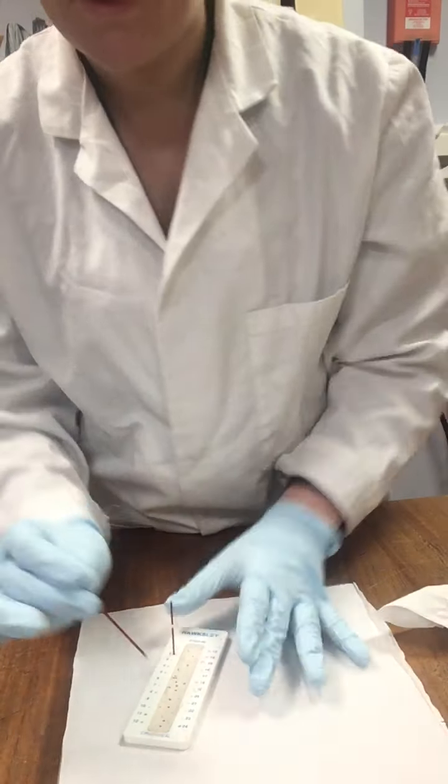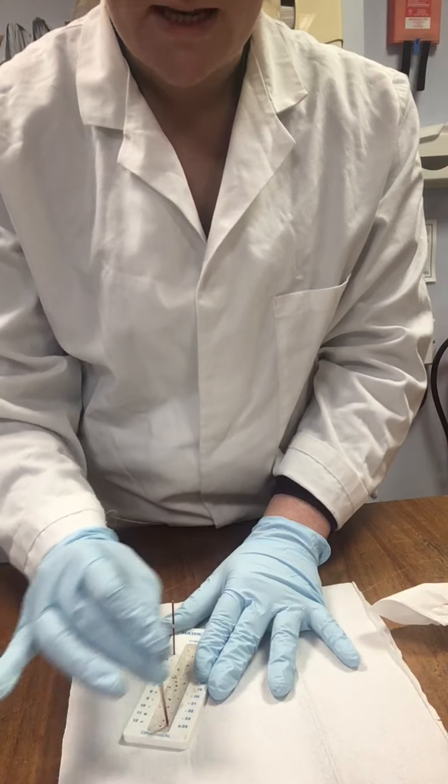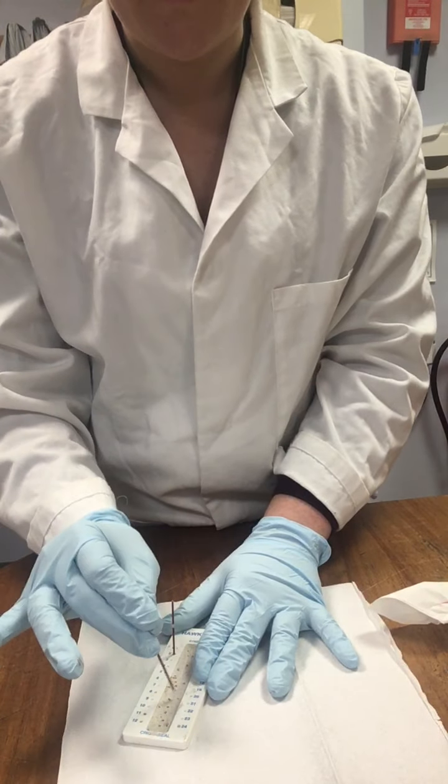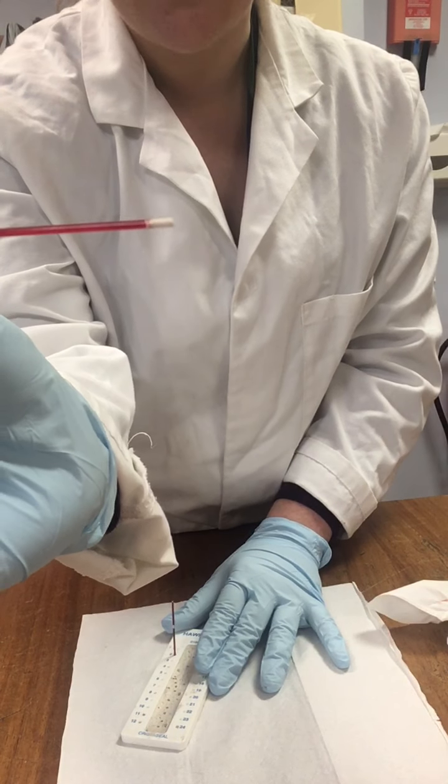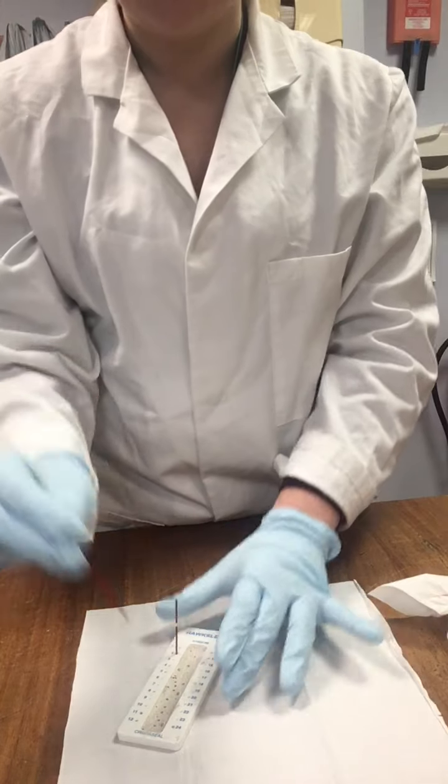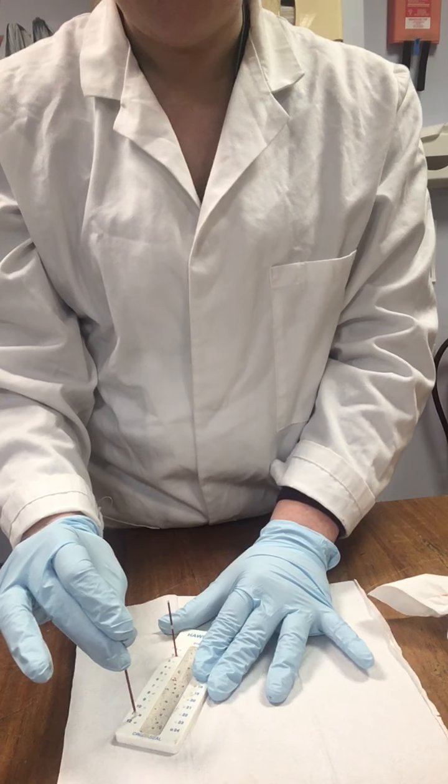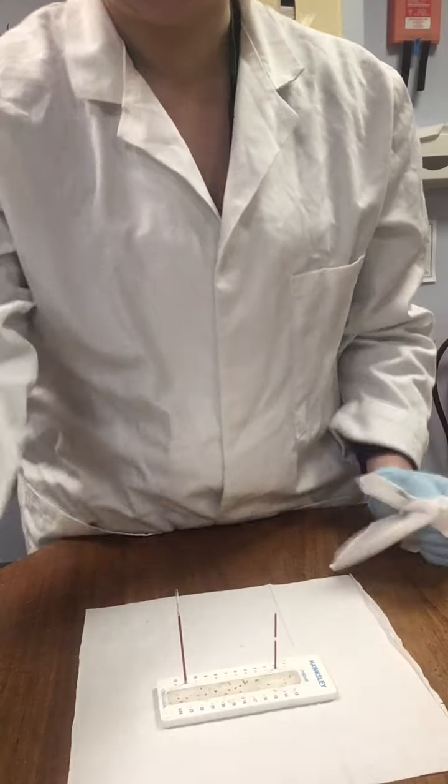And we then want to get our putty. And just placing our hematocrit into our putty, give it a couple of spins, as you can see. And what you're aiming for now is a nice clear plug at the end of your tube, which now means your blood sample isn't going to go anywhere. So, just pop that in your putty and you're ready to go.